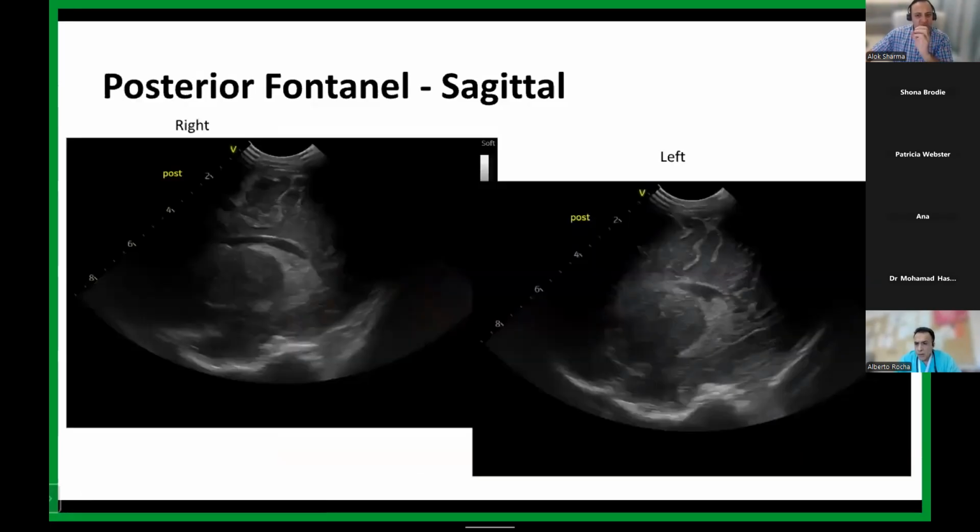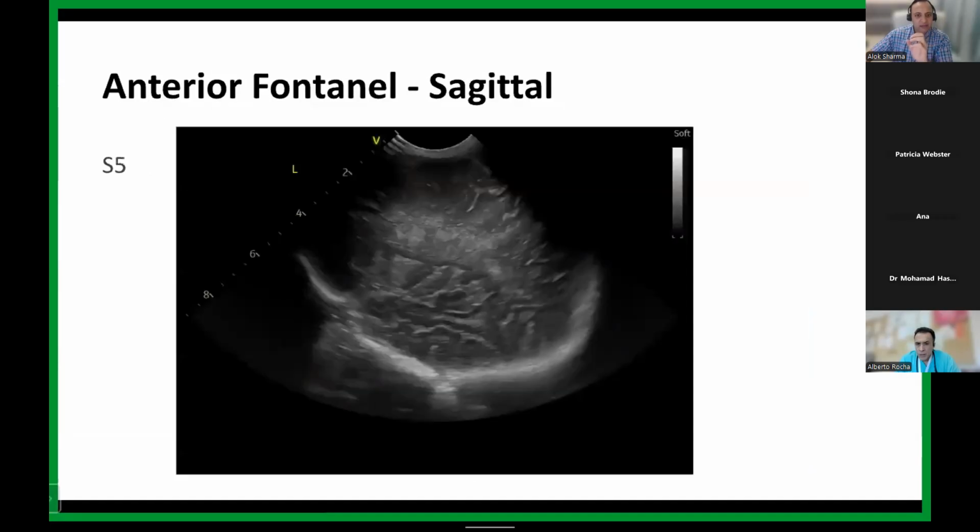But the question is, when you have echogenicity, following that area up to see how the hemorrhage evolves, and in particular that flare. So at the moment, they're completely separate. But sometimes you can develop a venous infarct secondary to a sinus venous thrombosis, and that can evolve into a PIVH on that left side. So again, taking a linear probe and looking at the sagittal sinus in this case to see if there's actually Doppler flow in it would be helpful.